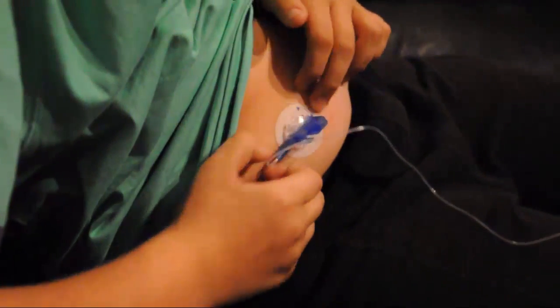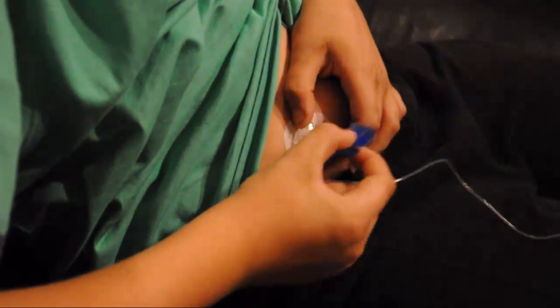Then you need to just click the little top button there to make sure that it's disconnected from the set and just pull that straight off. After, when that's come off, you just need to make sure that the sides are put firmly down to make sure it's still sticky. Grab the two plastic bits at the side, grab the blue bit and pull.